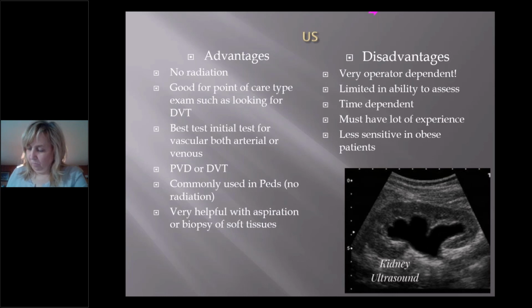A lot of times used with pediatrics because you don't have any radiation exposure. The problem is in peds, first of all, you got to have an experienced person doing the test, and you got to have an experienced person reading the test. Secondly, statistically, and studies will show that appendicitis is missed with a higher degree of frequency with ultrasound over CAT scan. So you really got to kind of weigh out those pros and cons as to what do you do.